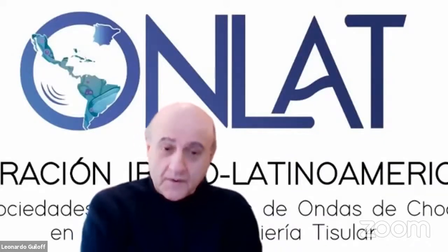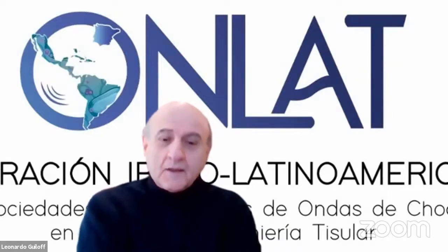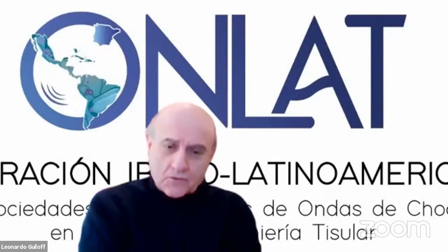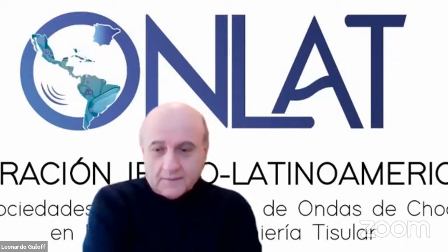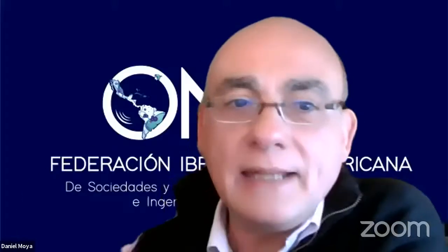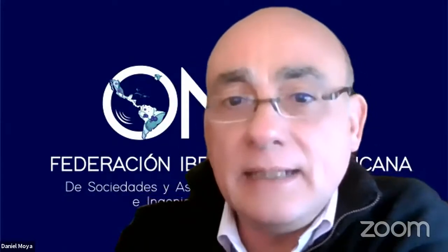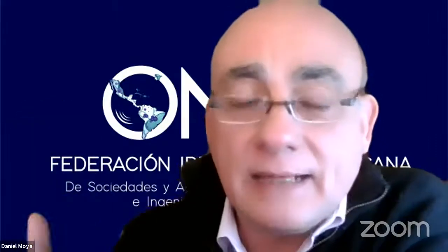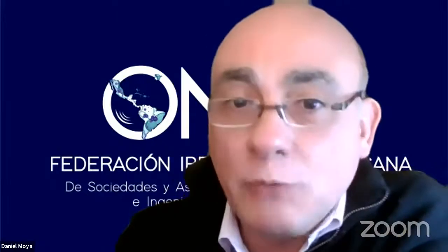And the last question for everybody. There are very interesting publications about this nowadays, by Daniel, also by Paul: do we have complications with shockwave technologies, or is it a completely risk-free technology? Dr. Moya. That's a good question. We divide the bad results and complications into 3 different groups. Complications related to an inaccurate diagnosis, which I could say is the most common reason for bad results, because having a device does not make us experts in all pathologies. So we must be aware of that.